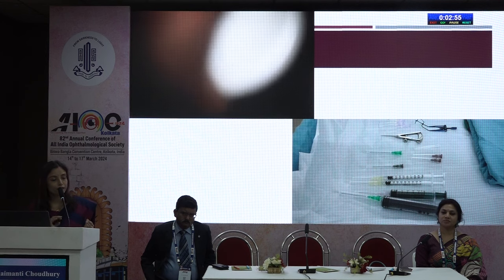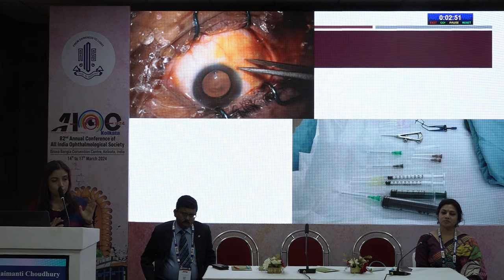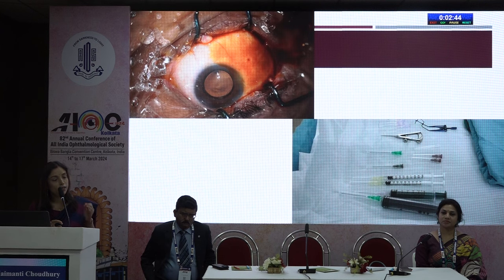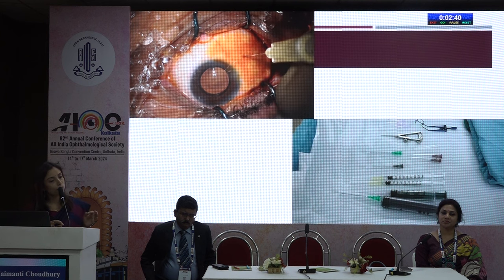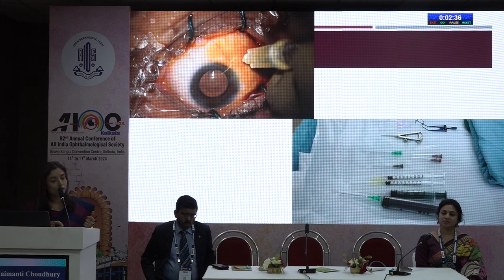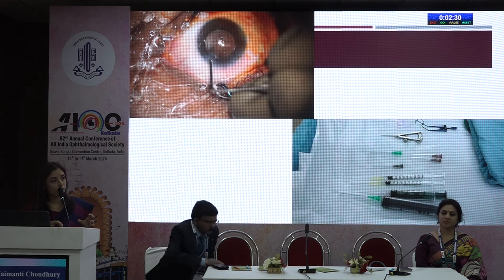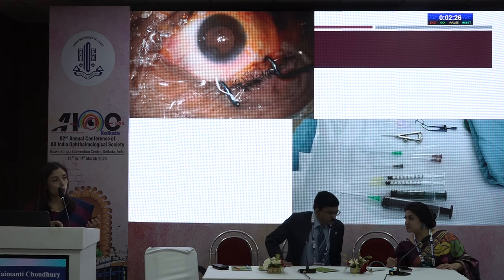Moving ahead, we also sometimes do injection with cataract surgery. Here you have seen a cataract surgery is done and you are seeing the lens is in situ. The visco wash has been done. Now again, we will put povidone iodine, mark the area, and give the injection. There is one extra step being done here, and that is the reason why I'm showing you this video. After the injection is done, we just have to tap the cornea a little bit to know if the eye is too hard. If you find the eye is too hard, you just have to let some aqueous or BSS out from the side port.